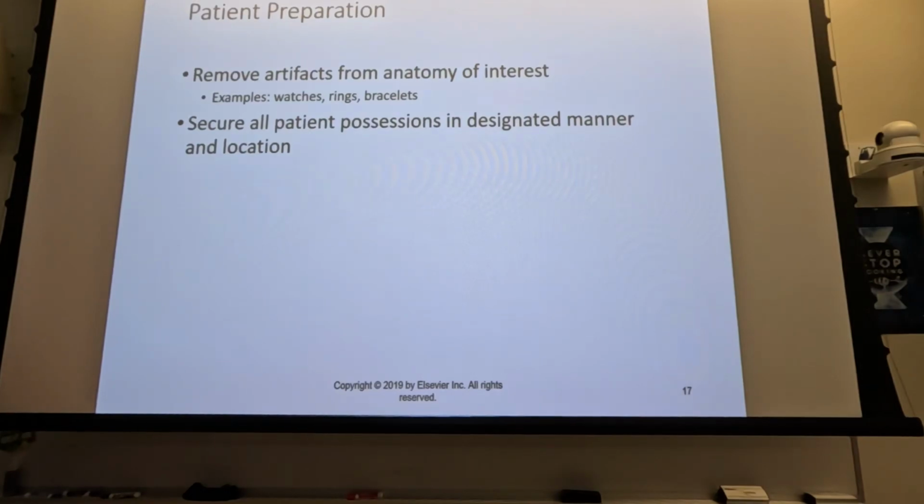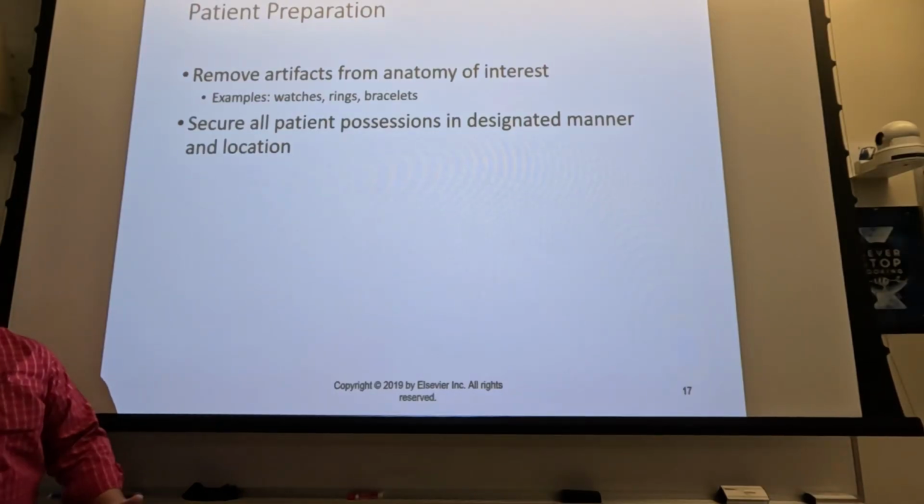With the gauze on the patient, the bleeding is contained, and it might even be clotted, but you pull that off, and you're going to want to make sure that you have something over the top of it, just to make sure it doesn't start spraying all over the place. And if it does, then you're just going to cover it back up. Don't put it on your image receptor while the patient's bleeding. Cover it up, stop the bleeding.